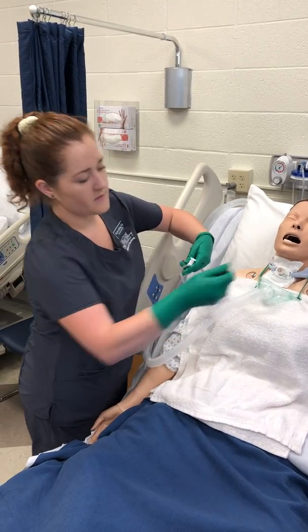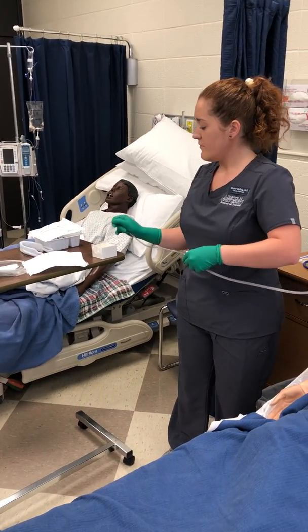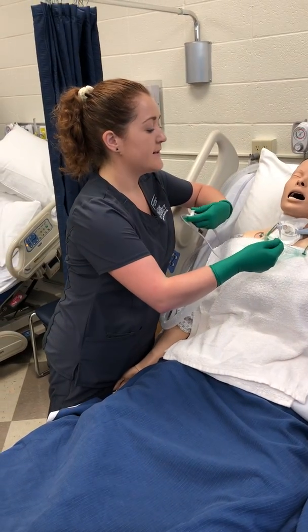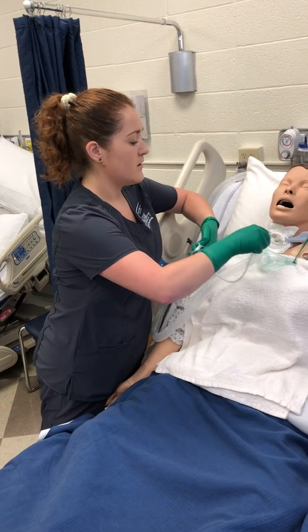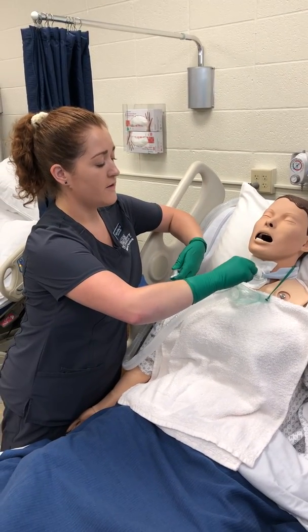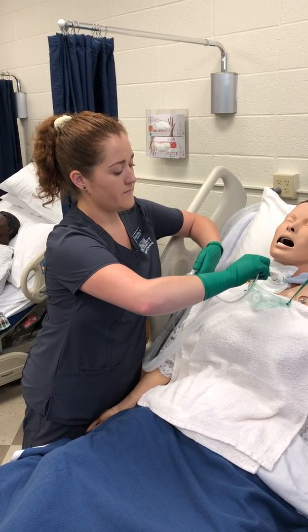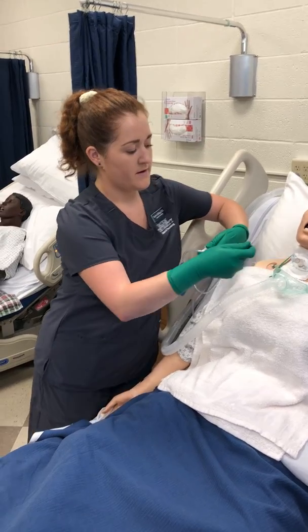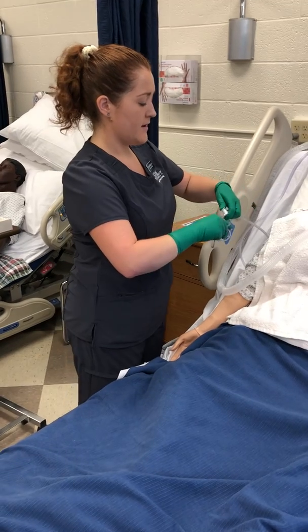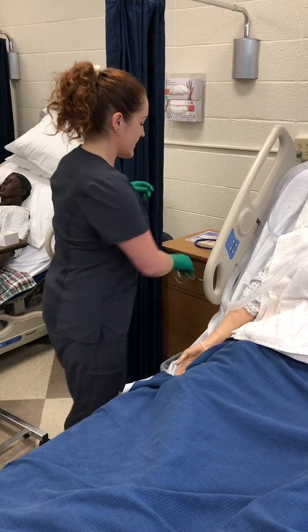I'm going to use intermittent suctioning and twirl the tubing around to make sure I get all areas of the trachea. I'm watching John's hand to make sure he's not indicating that he's in any distress — and he is not currently. I'm going to instruct him to cough to try and get up any additional secretions that may be stuck there. Now I'm going to remove and discard the catheter.